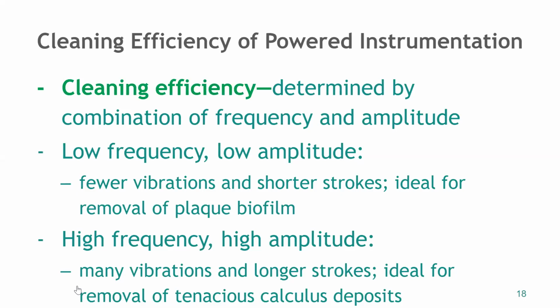High frequency and high amplitude is going to be many vibrations and longer strokes. And this is ideal for removal of tenacious calculus deposits. Or like I was talking about, when we have that really, really heavy supra that's really tough to get off, and we're kind of fighting through the thickness of it.